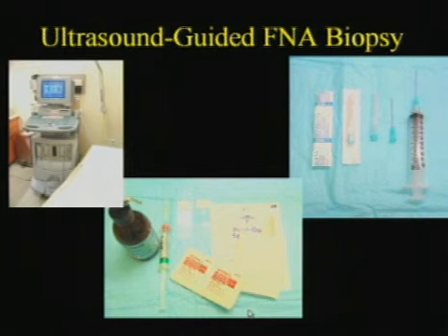So this is the basic technique. Again, we have the ultrasound machine, table for the patients. I treat this similar to a blood draw and only use alcohol for sterile technique. Again, this type of biopsy does not cause much pain. Some people don't use any kind of anesthetic.